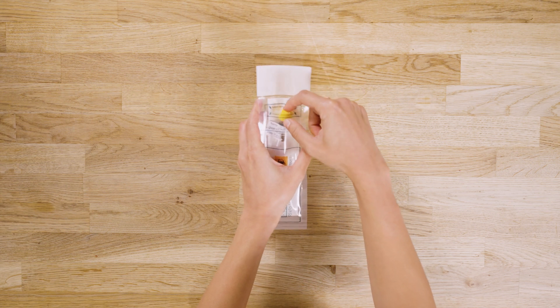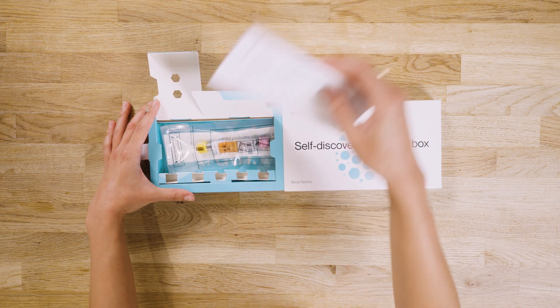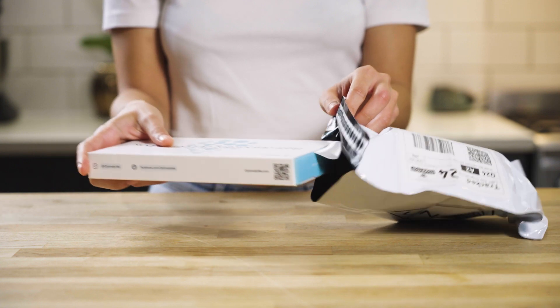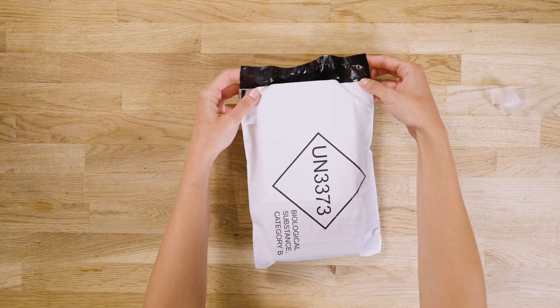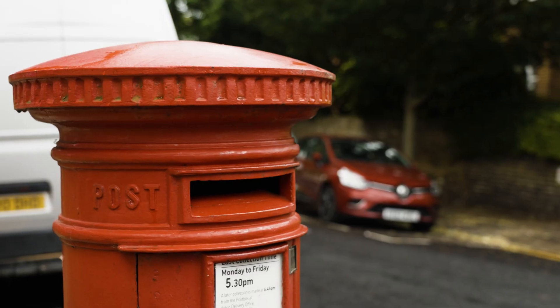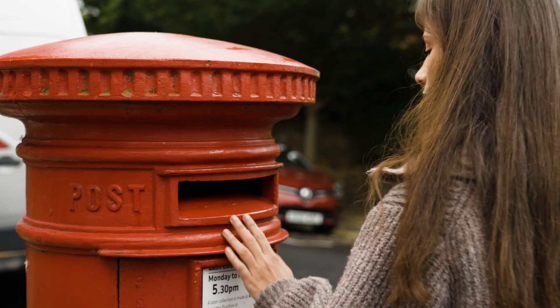Place the tubes in the protective pouch and seal it. Put the pouch and return form inside the test kit box. Place the test kit containing the sealed pouch and return form inside the prepaid envelope with our lab's address. Post it in your nearest priority post box and then dispose of any components left over.